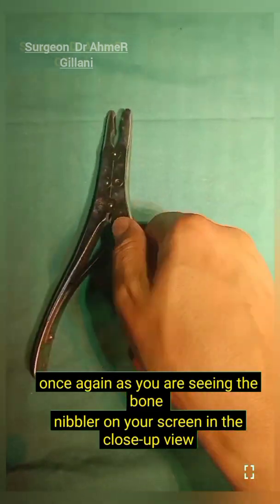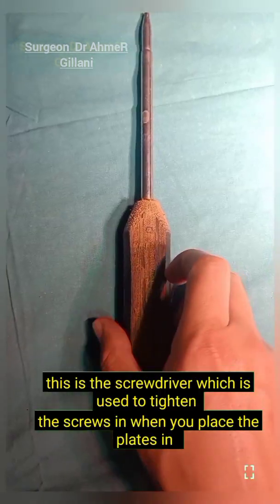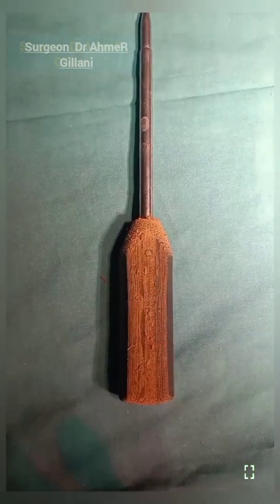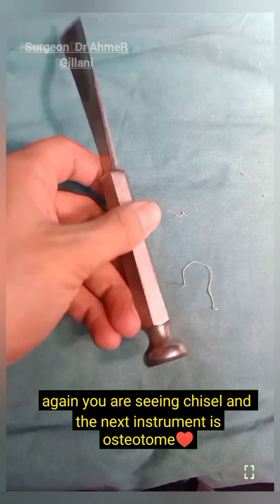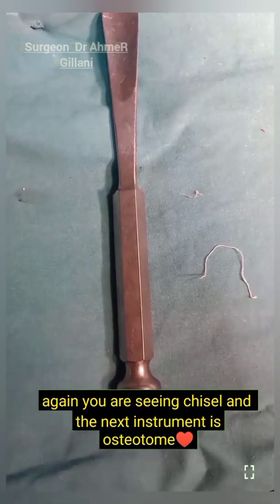Once again you are seeing the bone nibbler in close-up view. This is the screwdriver, which is used to tighten the screws when you place the plates. Once again you are seeing the chisel, and the next instrument is the osteotome.